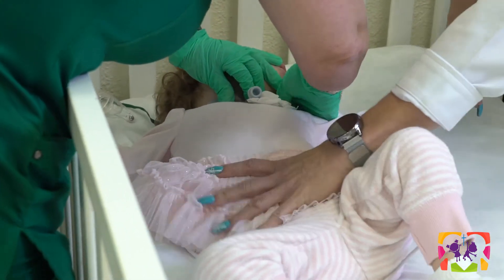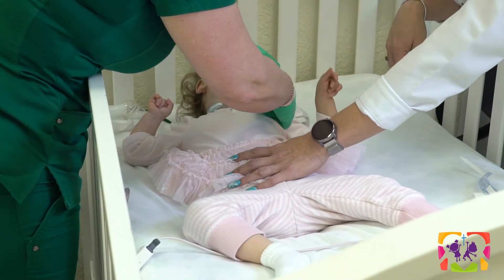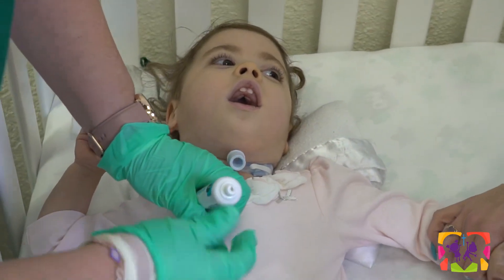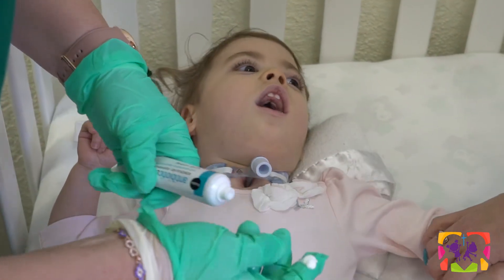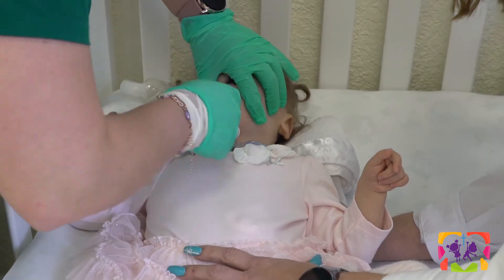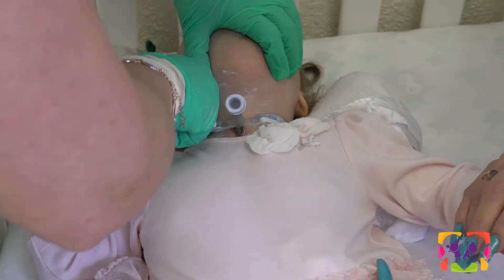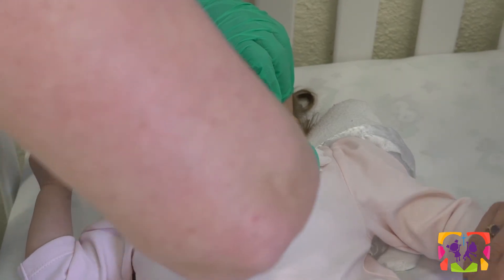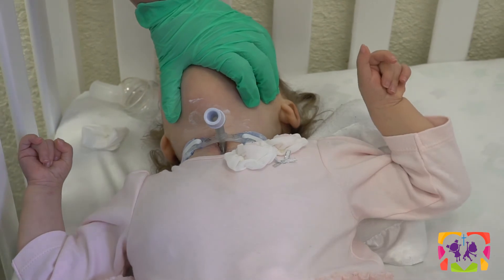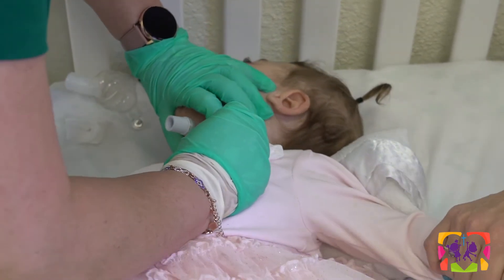This way you don't risk the trach coming out. You want to be sure not to put the trach collar too tight — you should be able to fit two fingers underneath it. We're going to apply some triple antibiotic, and then afterwards you'll apply a 2x2 to absorb any secretions that may come around the stoma.